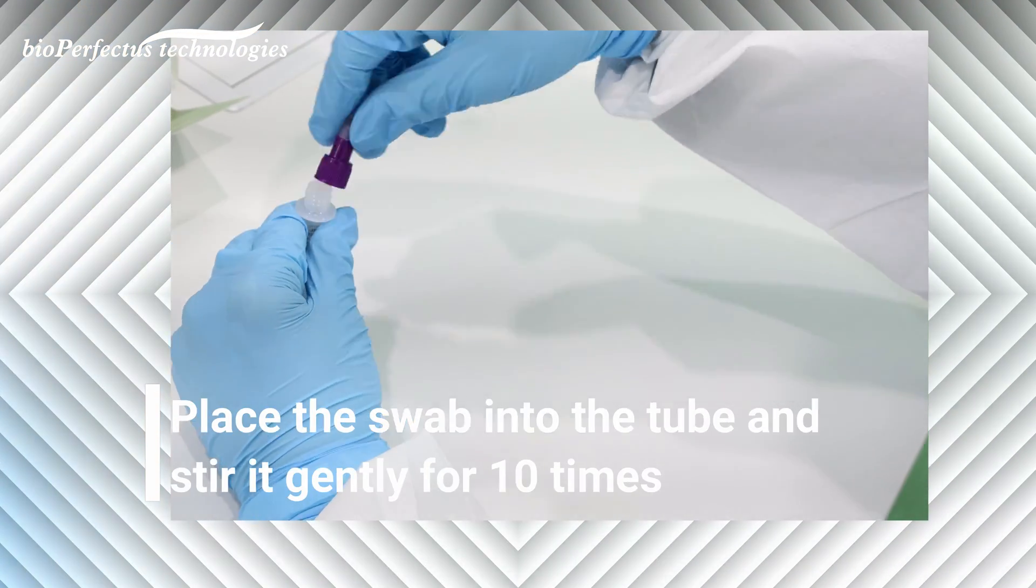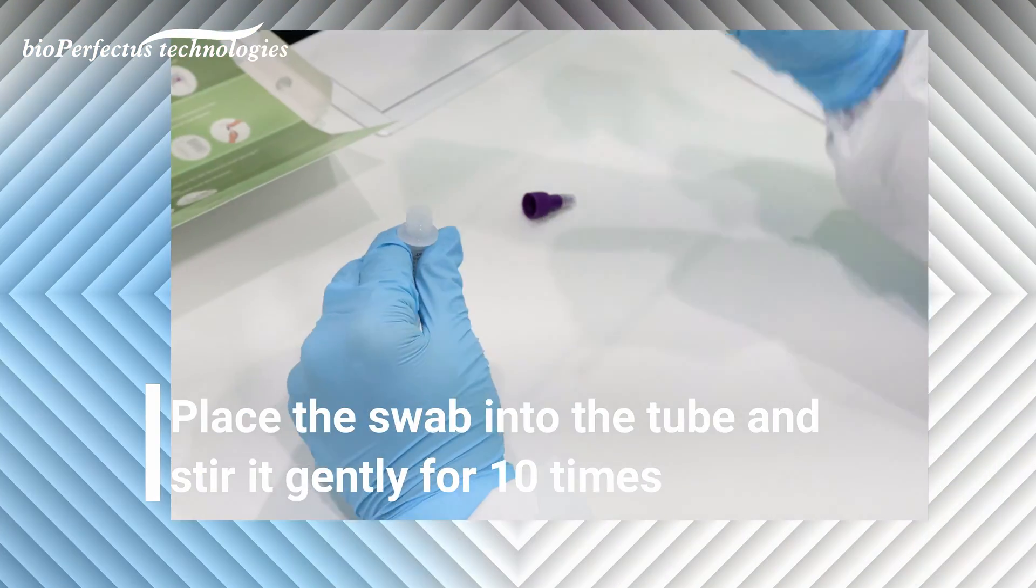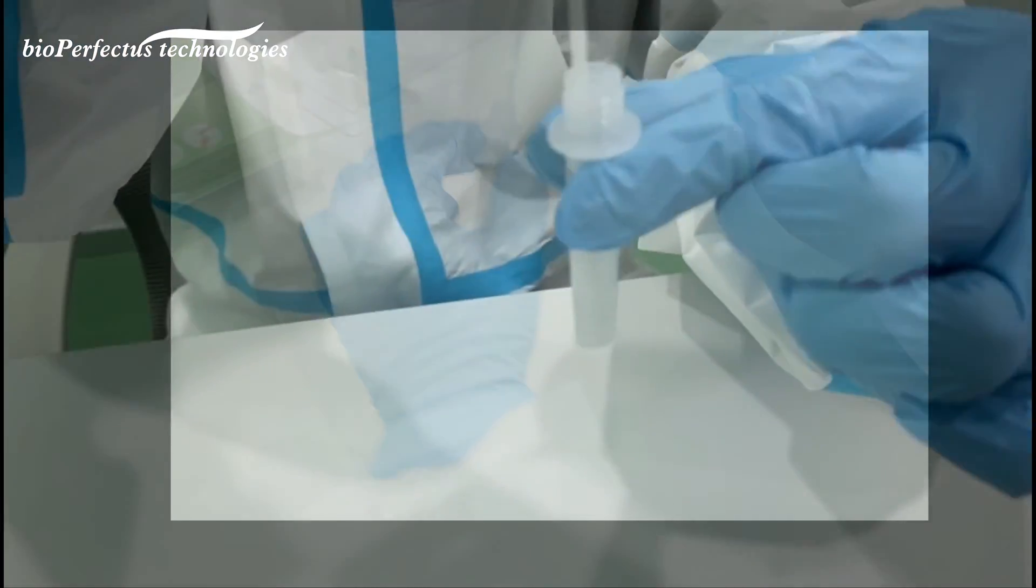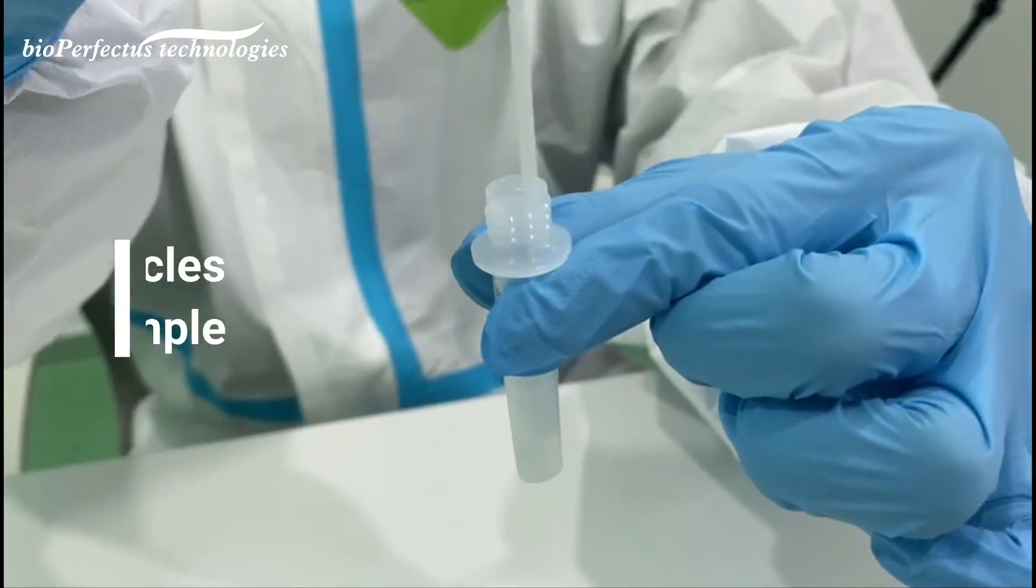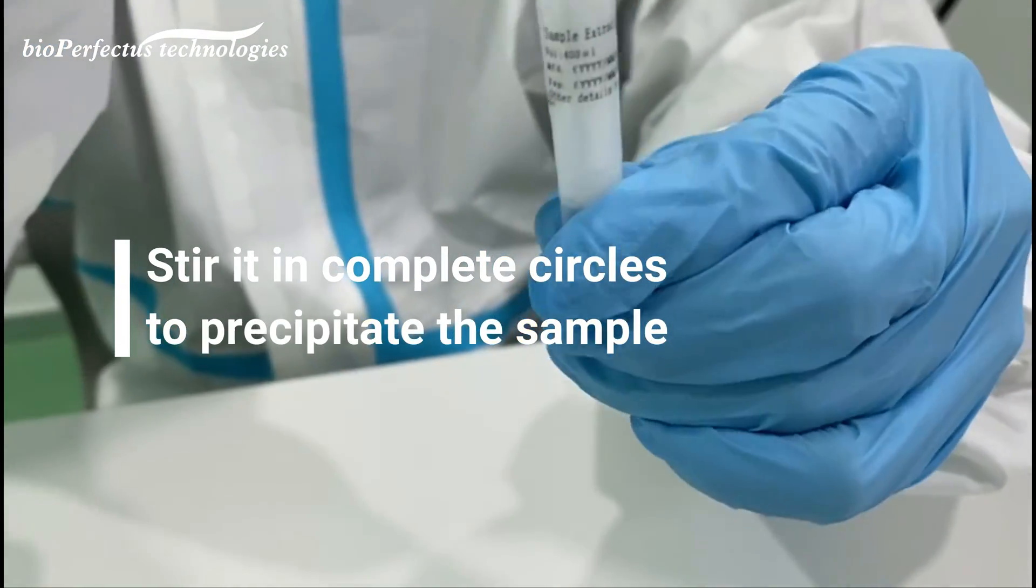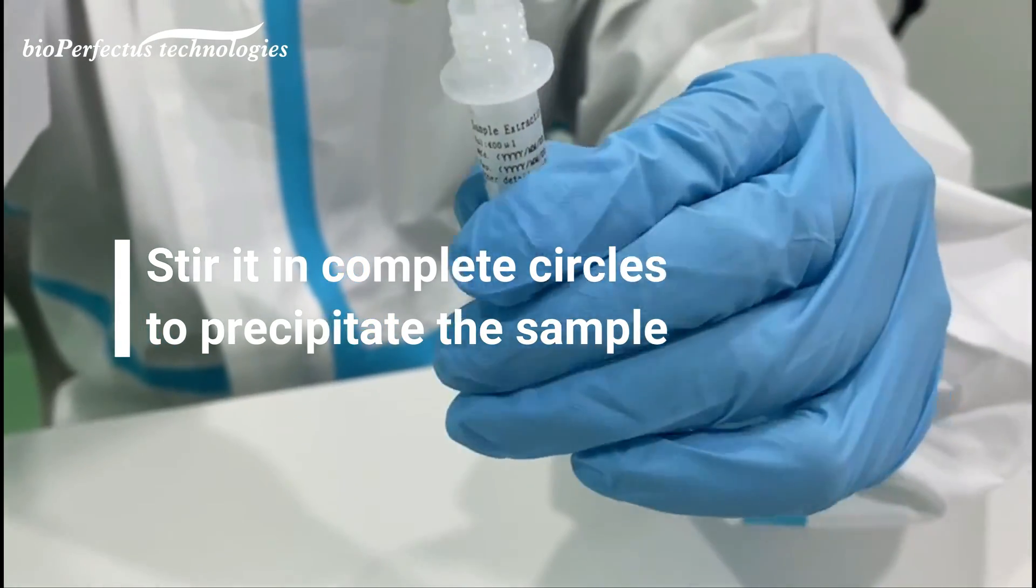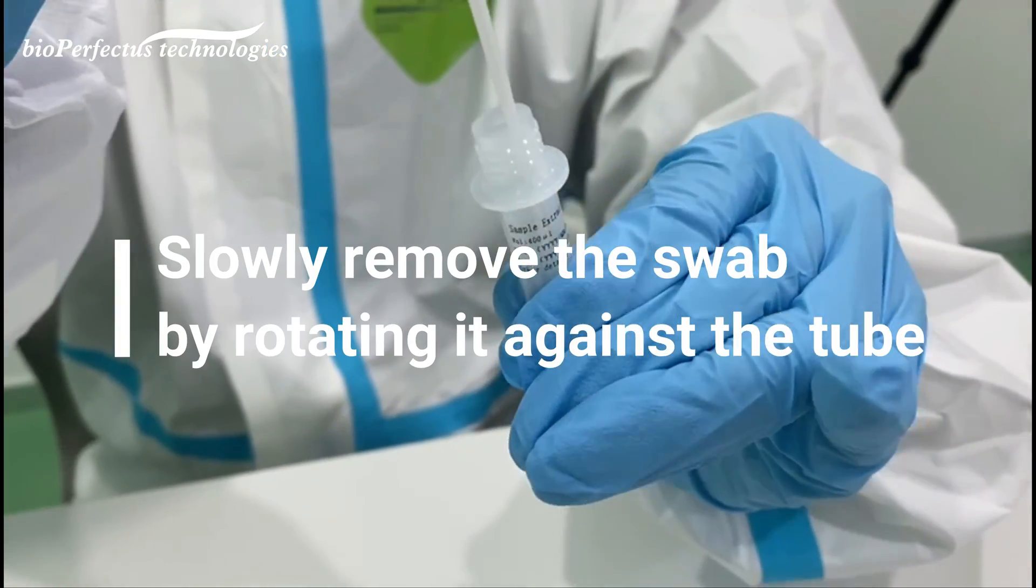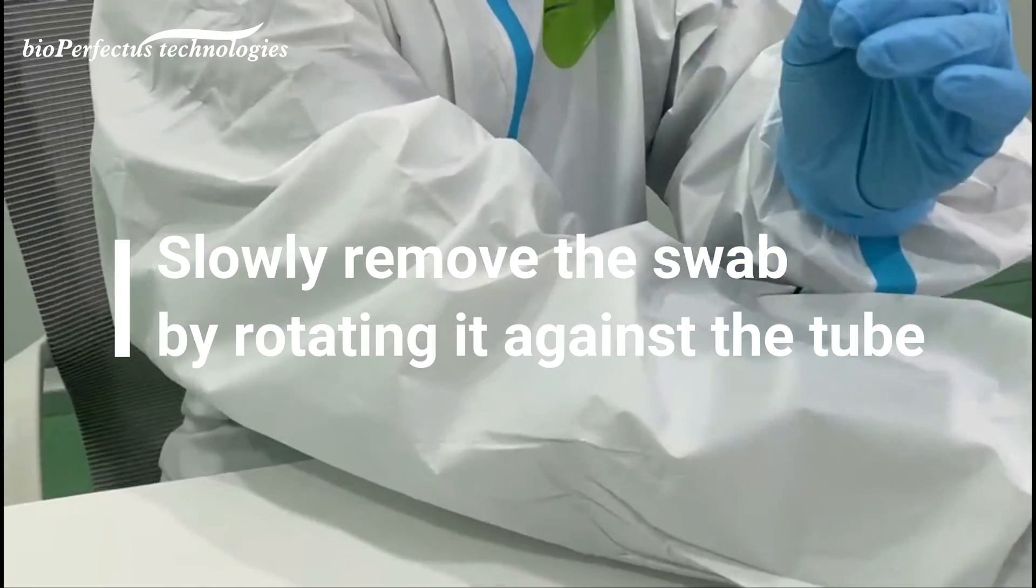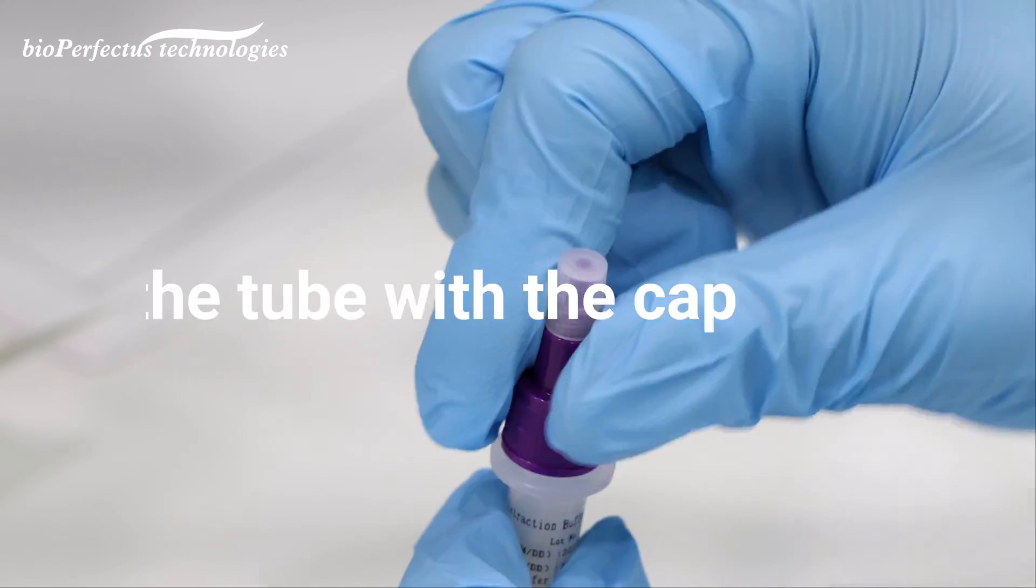Place the swab into the tube and stir it gently for 10 times. Stir it in complete circles to precipitate the sample. Slowly remove the swab by rotating it against the tube. Close the tube with the cap.